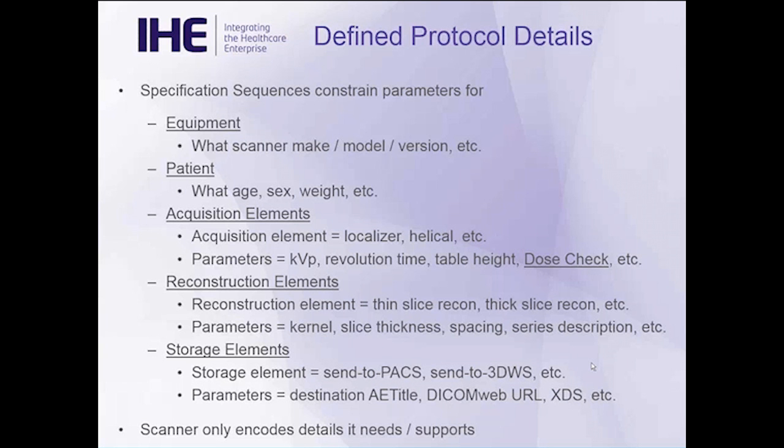To highlight, this is also where you can put in dose check triggers. Anyone who's been following the radiation dose tracking work that's been going on in the last number of years may be familiar with dose check, where when a protocol is modified and the modification exceeds a certain predicted dose threshold, notifications will come up to the operator. Setting those thresholds can be a bit tedious, and if you want to set them consistently across different vendors, using your protocol management workstation would be a convenient way to get those set.